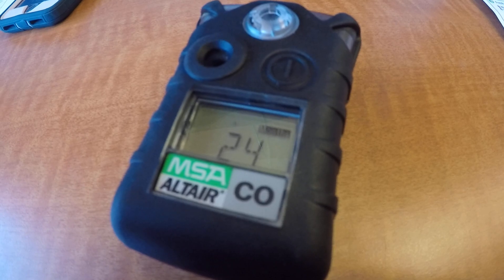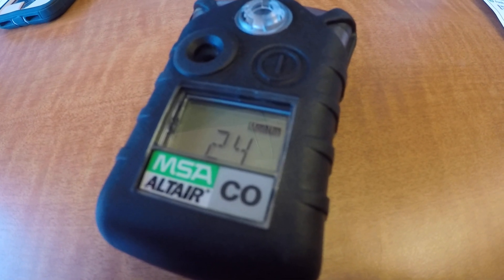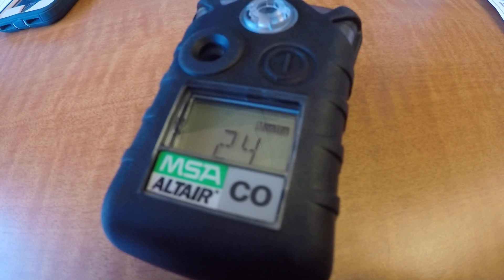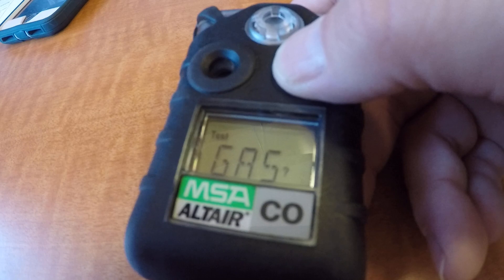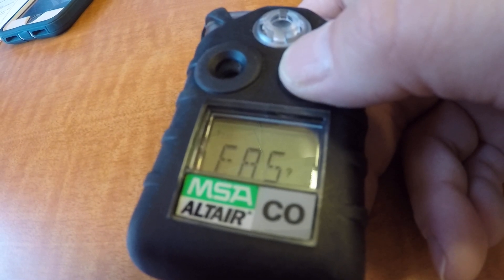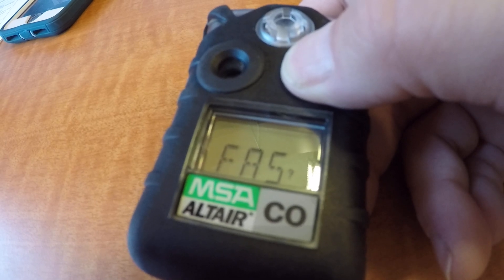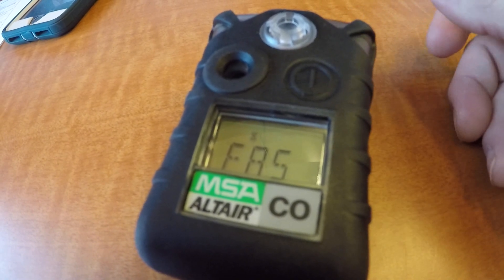Press the test button once and you're going to see the test gas or the question mark displayed, then press and hold the test button to enter calibration mode. Now that's if we want to do a fresh air setup — press the test button again, and now it's doing the fresh air setup.